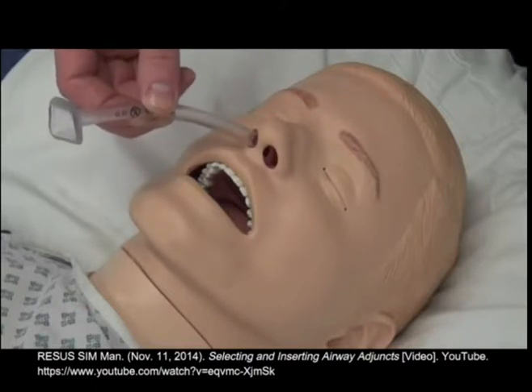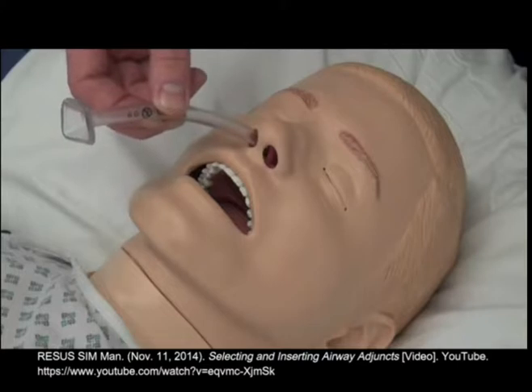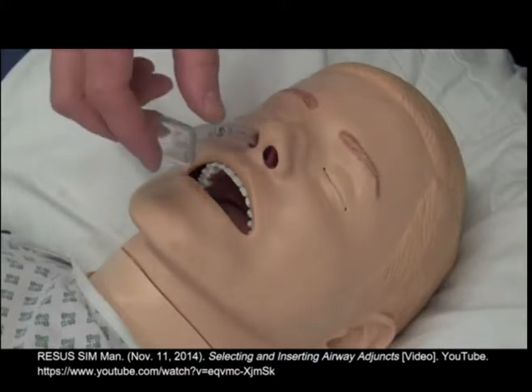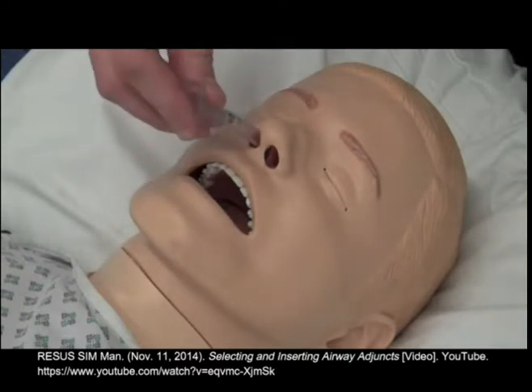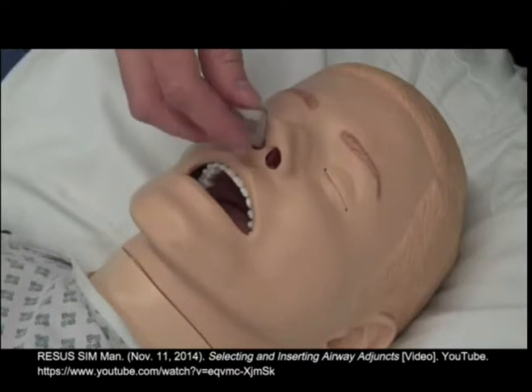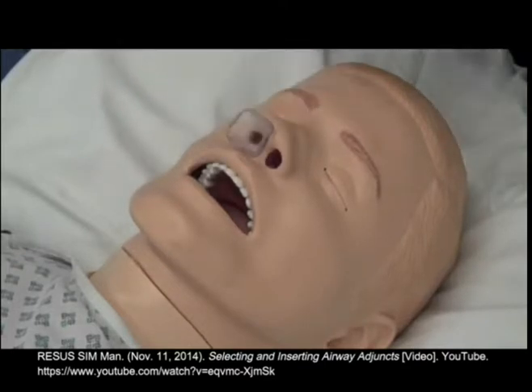When inserting it, advance it straight back as if you were aiming for your right knee. A small twisting action may help ease the nasopharyngeal airway into the nostril. Advance it up to the plastic base, or until you meet resistance.